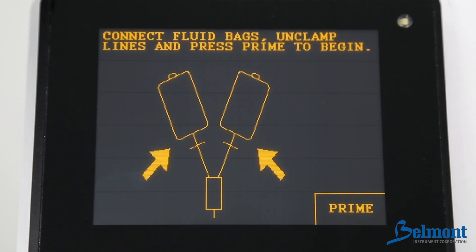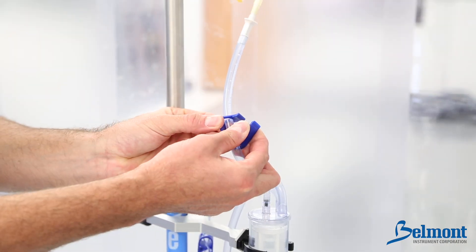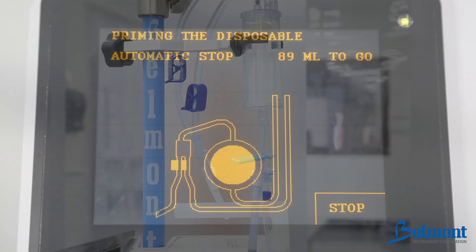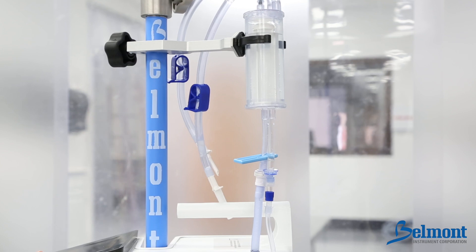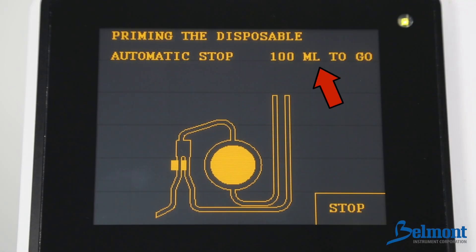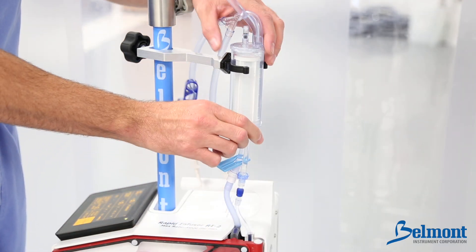Press next to move to the prime screen. You will now be instructed to connect fluid bags and unclamp lines. When ready, press prime to begin priming the disposable circuit. The roller pump will automatically prime the system in about 13 seconds. Fluid will be drawn through the tubing while the air will be directed out through the recirculation and vent line. During prime, the 100 milliliters to go will count down to zero. If the Belmont Rapid Infuser RI2 does not count down or resets back to 100 mLs, confirm that there is enough fluid in the system and that the tubing is not kinked or stretched too tight.